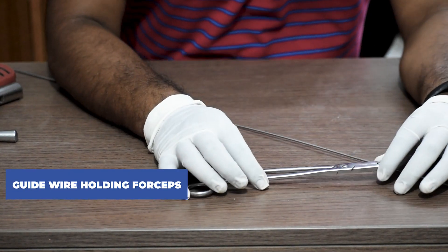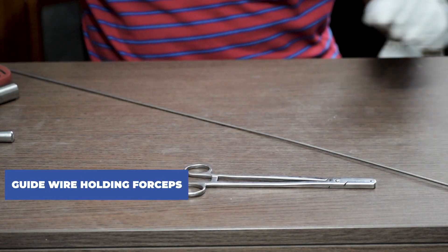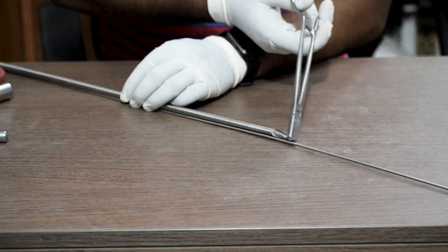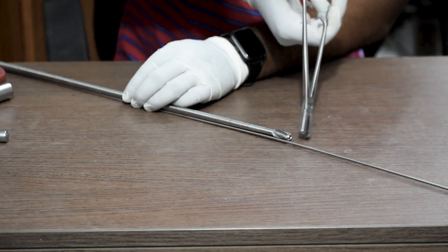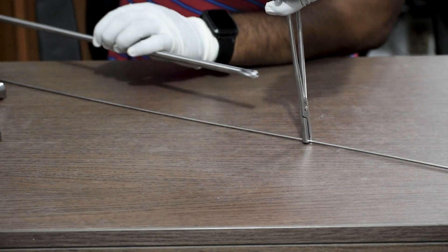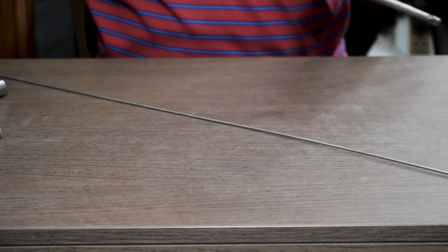This is another piece of equipment — the guide wire holding forcep. It is used for holding the guide wire while reaming, so that when we are taking out the reamer, the guide wire does not come out with it. We press and hold the guide wire while taking out the reamer.